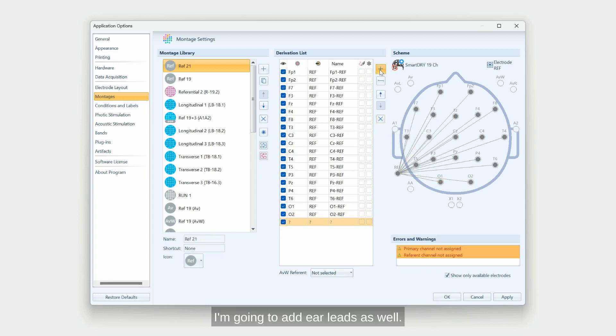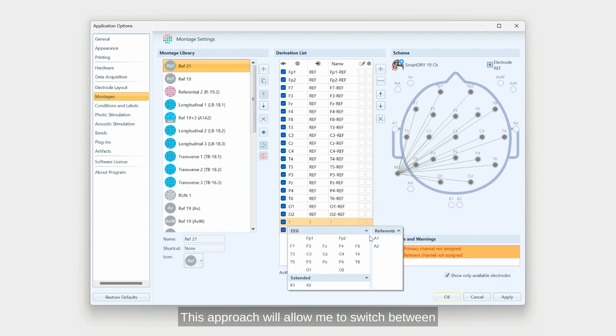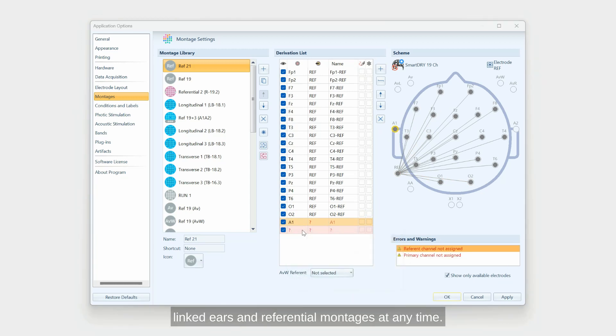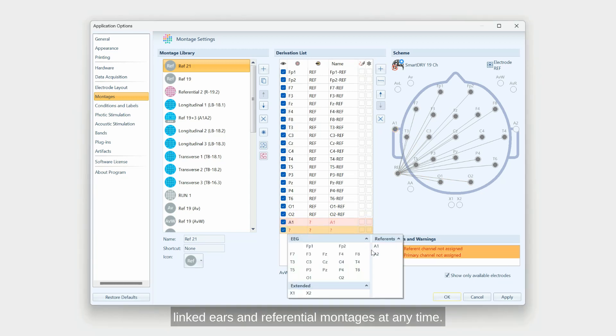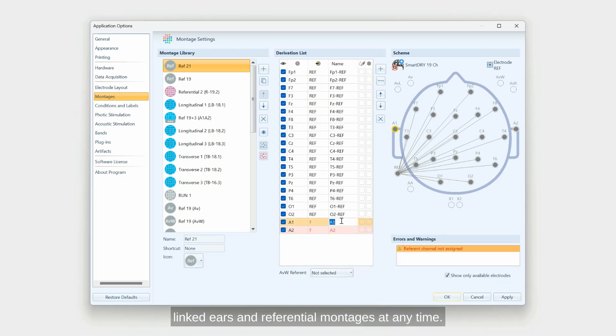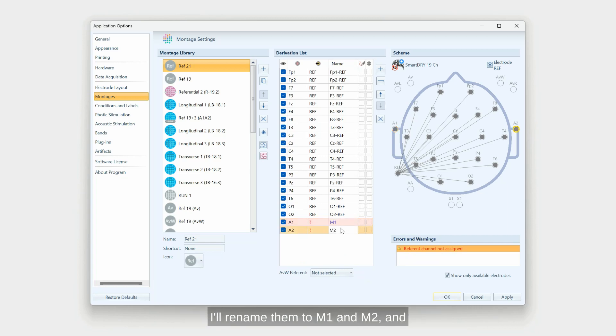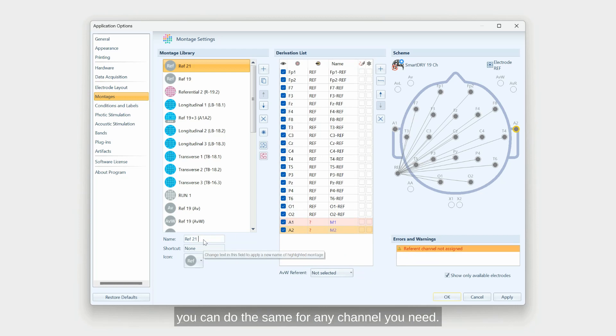I'm going to add ear leads as well. This approach will allow me to switch between linked ears and referential montages at any time. As in my case, I have them installed on mastoids, I'll rename them to M1 and M2. You can do the same for any channel you need.